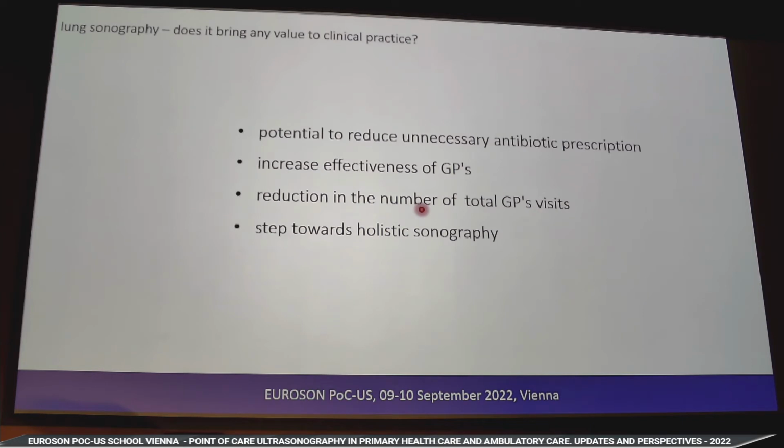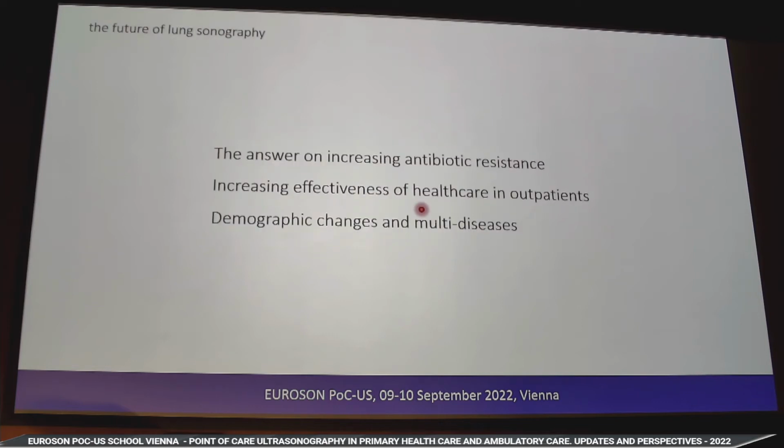There are now different ongoing studies which evaluate the value of sonographic examination in the prescription of antibiotics, in order to reduce unnecessary prescription of antibiotics.